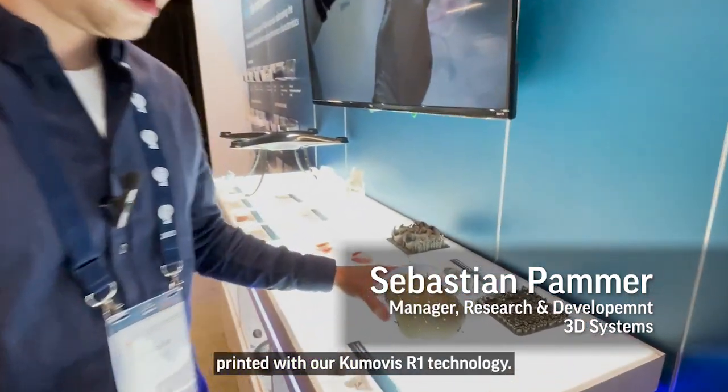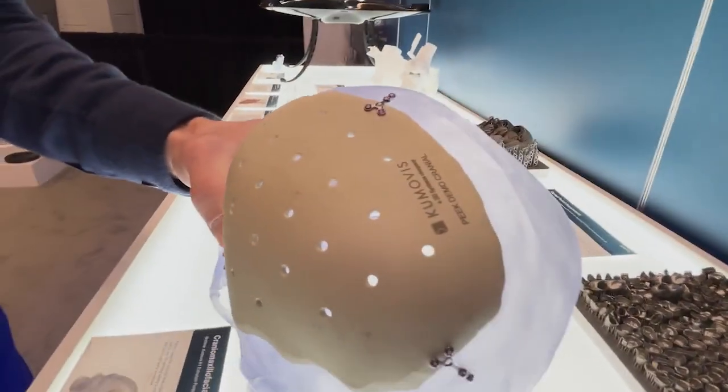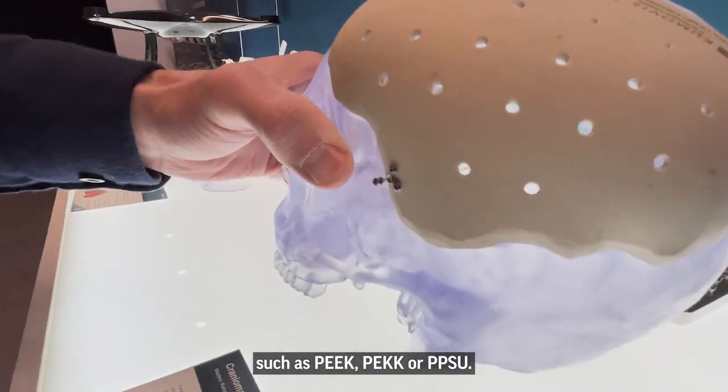I'd like to show you some parts printed with our Kumovis R1 technology. It's a 3D printer designed to process high-performance polymers for medical applications, such as PEEK, PEKK or PPSU.